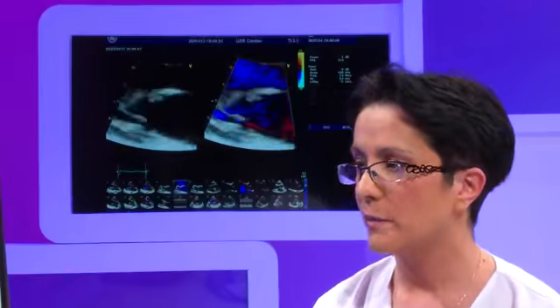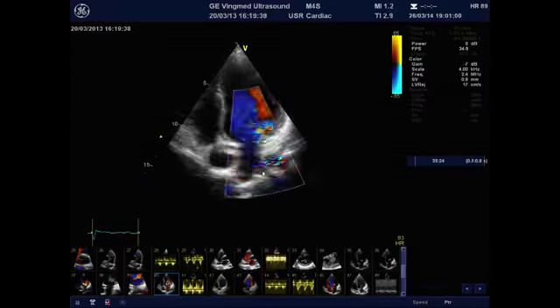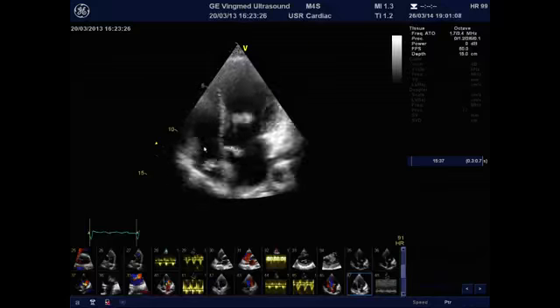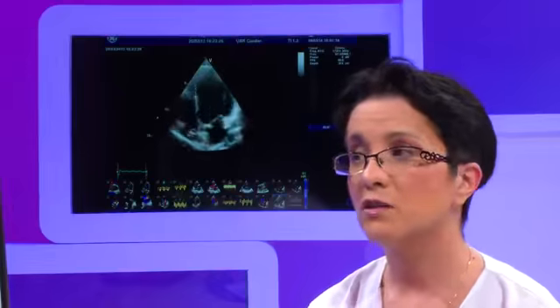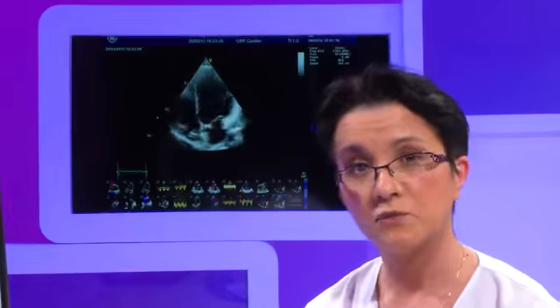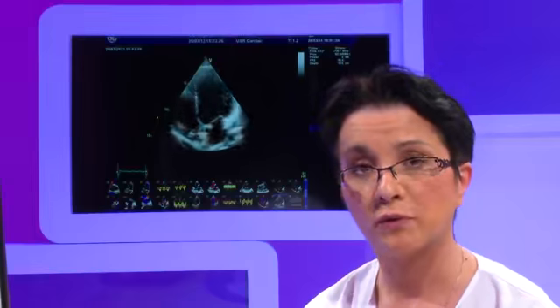Another observation in this patient, for which the apical views confirm the existence of the mitral regurgitation with an eccentric flow, is that in her right atrium there is a mass, and actually when she had surgery for her valve pathology, this mass was removed and proven to be a thrombus. The presence of intracardiac thrombus in patients with antiphospholipid syndrome is also a possible finding, usually appearing incidentally and asymptomatic, but also possibly associated with peripheral or pulmonary embolus.